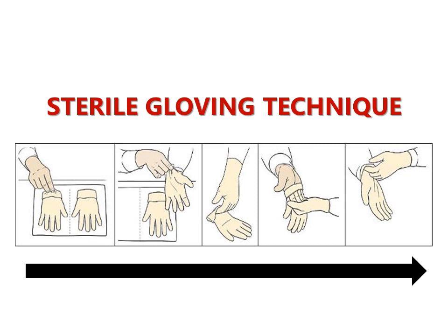Now, this is very, very important. After you perform surgical hand washing, you are now ready to go to your patient and perform the procedure. But you can do the procedure only after you perform sterile gloving. How is sterile gloving different from clean gloving? In clean gloving technique, there's no special way of putting on your gloves. However, in sterile gloving technique, you need to follow certain procedures, certain steps, or else you will end up contaminating the gloves. Remember, our goal in sterile technique is to make sure that no microorganisms come in contact with the wound. And the proper way of sterile gloving is one way of ensuring that you are not contaminating the wound.